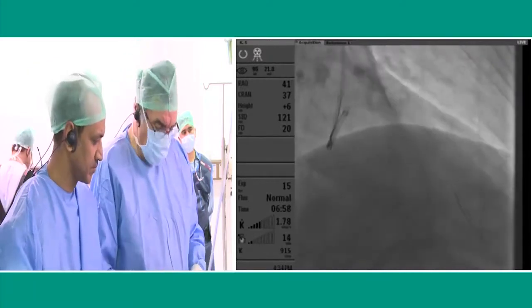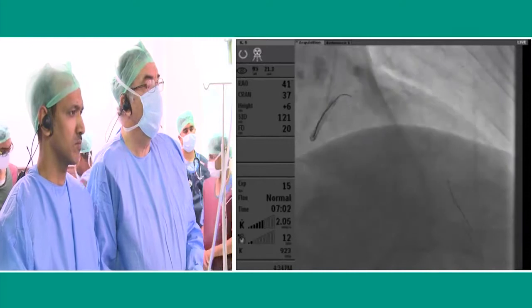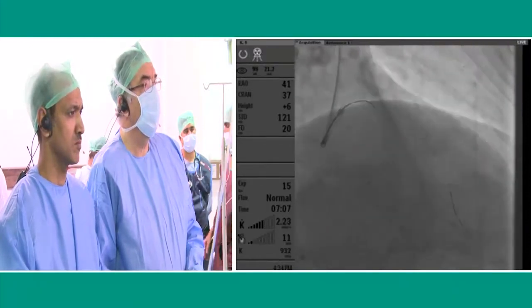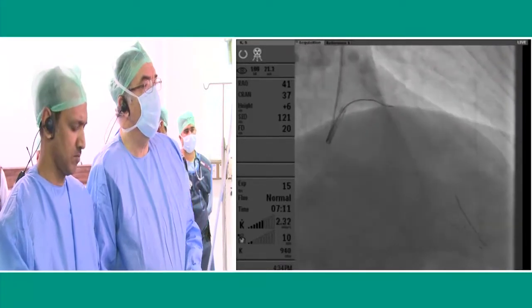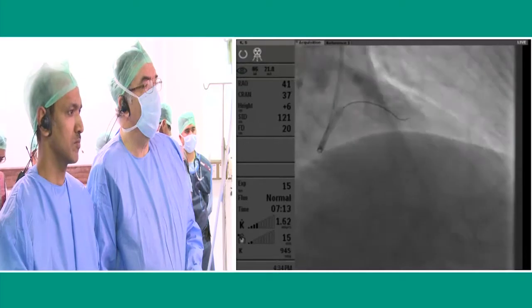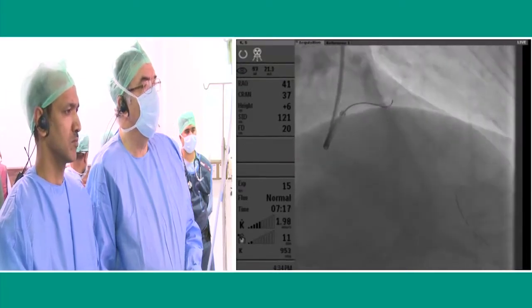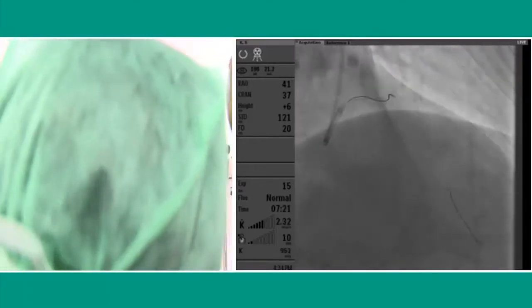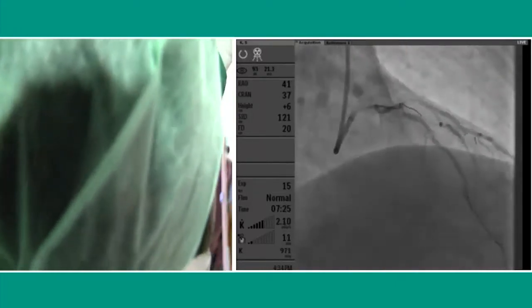May I ask our panel, Dr. Wong, will you prefer the two-stent technique or some other different technique? I will probably do a provisional one because the thallium scan shows the ischemia in the inferior wall. I'm not so sure whether the circumflex OM branch is ischemic. So since the ostium of the circumflex is not that diseased, I'll do a provisional stenting for this case.